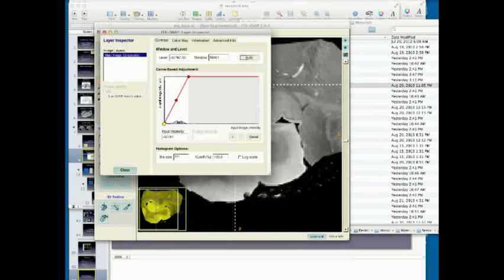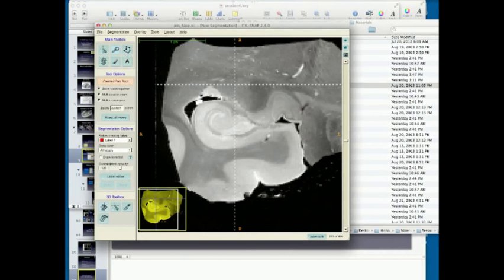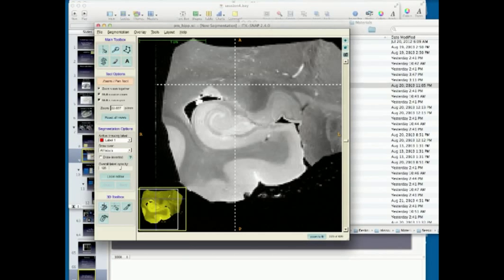So here is a coronal slice of the hippocampus, and this looks a lot like what I showed you before. And as I said, we're going to be segmenting dentate gyrus, the CA, and the white matter in between them. So remember this right here, this oval in the middle is the dentate gyrus. This tissue around it is the CA structure, and this dark band in the middle is the SRLM. So the first thing we want to do before we start segmenting is set up the labels so we're all working under the same structure here.